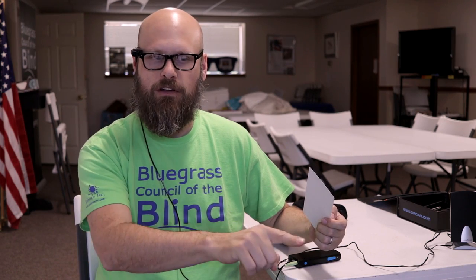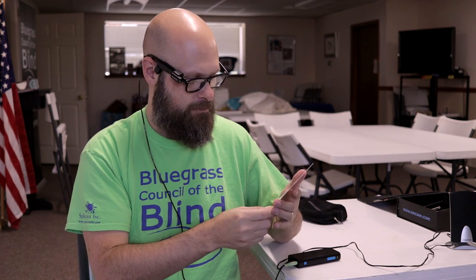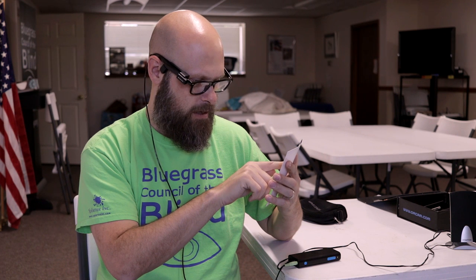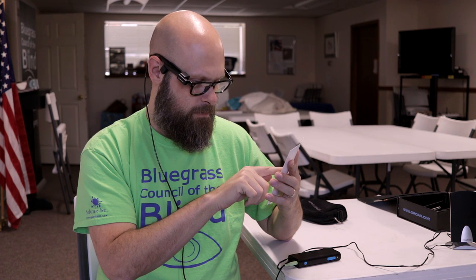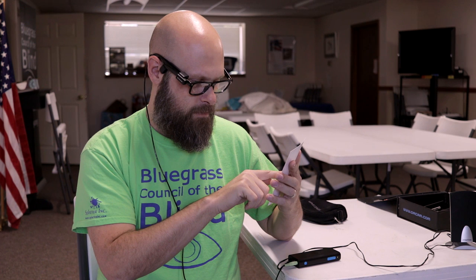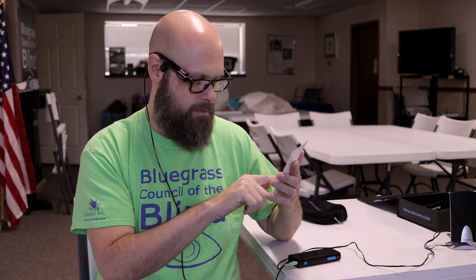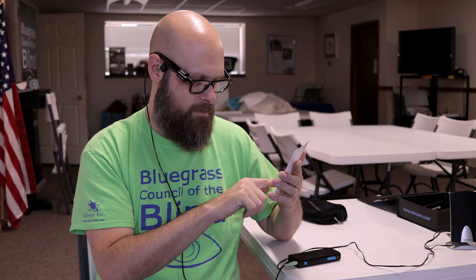Another cool feature of the OrCam is that it will track your finger position, so whatever you point at it will read. If you're looking at a list, for example, and you just want to know one thing on the list, you can point at it — or a menu — and as you pull your finger down the list, it'll read each line. [Demo reads: '2-Euro, 1,450 and Broadway, Lexington, Kentucky 40505, inside the CV building, across the street from Legends Baseball Field.']